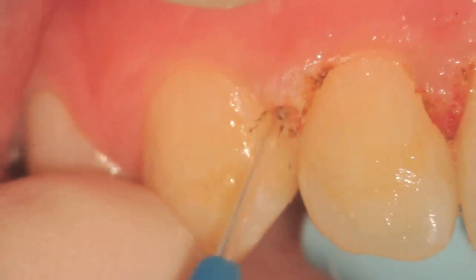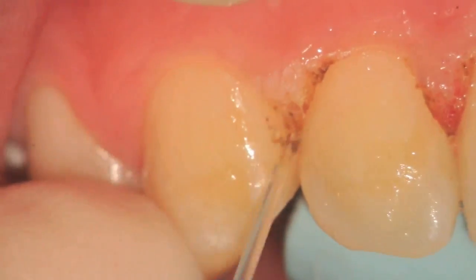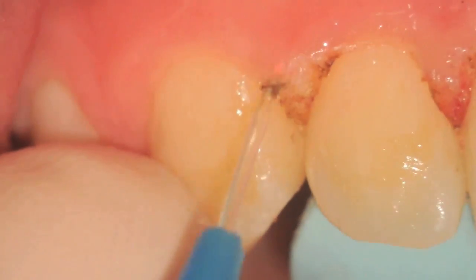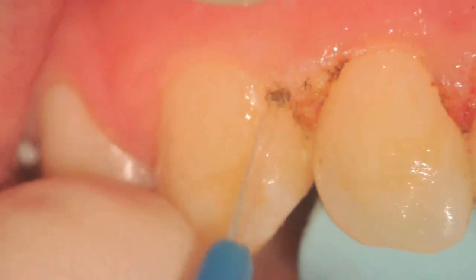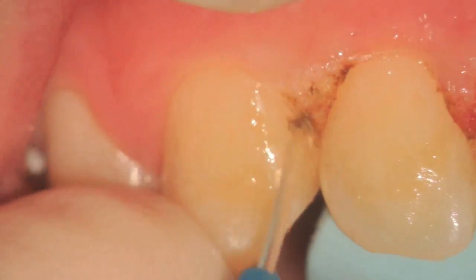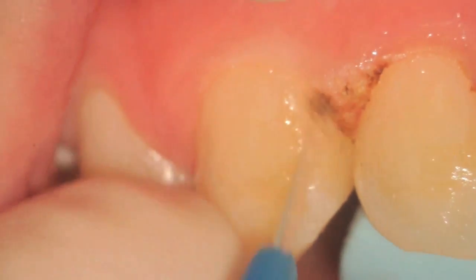In this case we're working mainly on the mesial and distal of the lateral incisor to give you an overall view of the procedure. This procedure, done with topical anesthetic only, took roughly 15 minutes for the upper and lower anterior teeth.